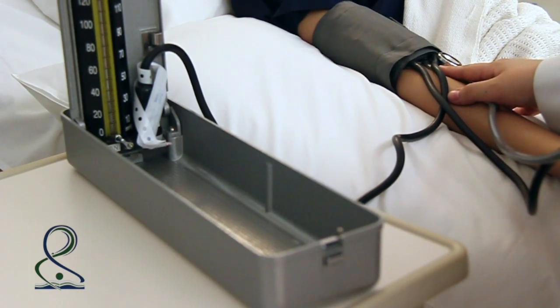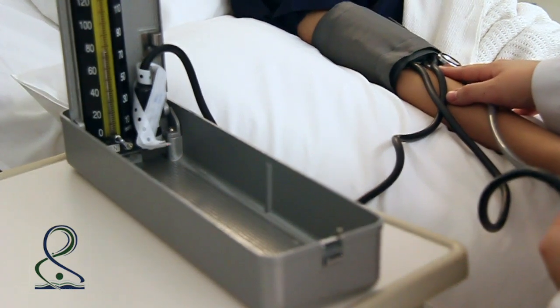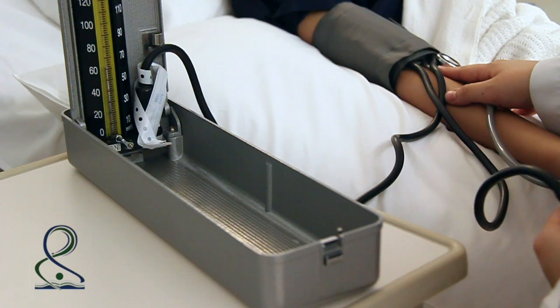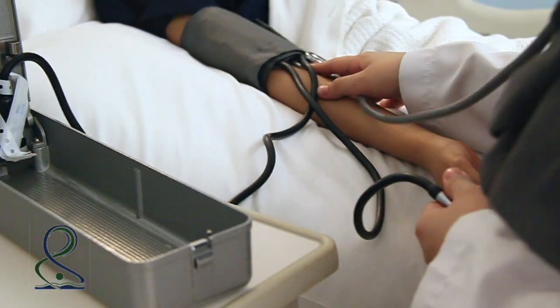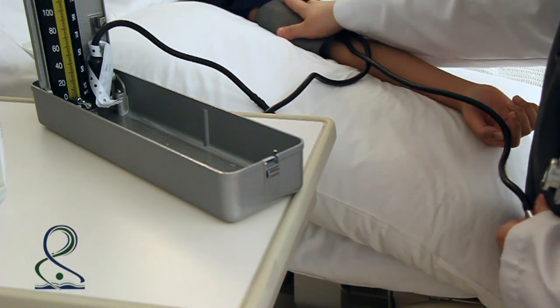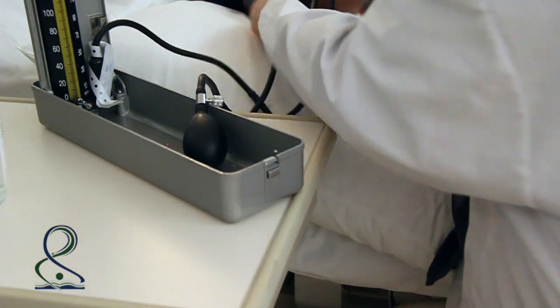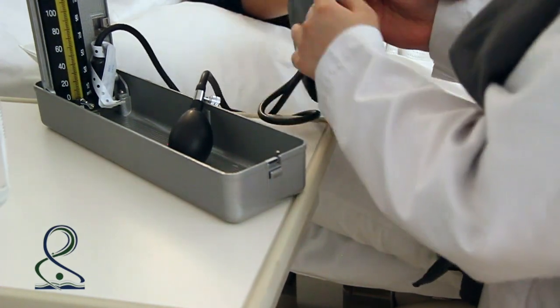Read the pressure on the manometer at eye level. Release the valve on the cuff and deflate it slowly until you hear the first pulse, which is the systolic pressure, then note the diastolic pressure, which is the last pulse you hear. After taking your reading, do not leave the cuff inflated for a prolonged period — deflate it completely. Remove the cuff from the client's arm and perform hand hygiene.